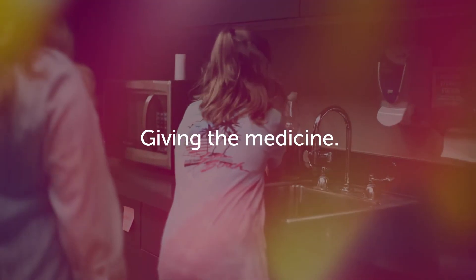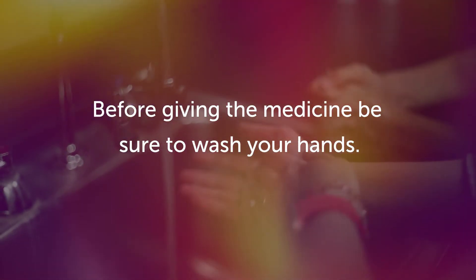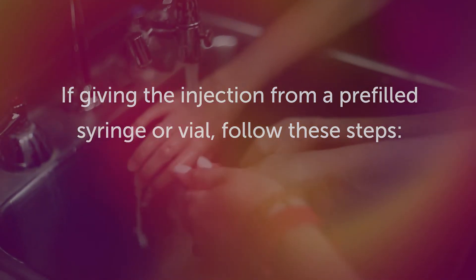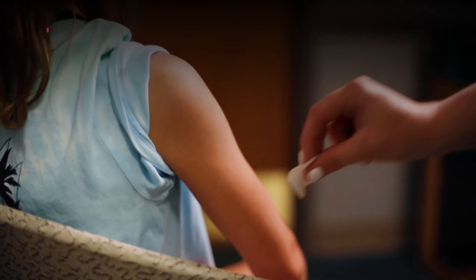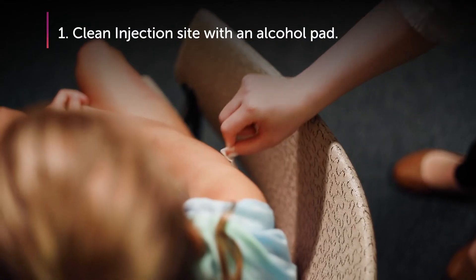Giving the medicine. Before giving the medicine, be sure to wash your hands. If giving the injection from a pre-filled syringe or vial, follow these steps. Step 1: Clean the injection site with an alcohol pad and let it air dry.